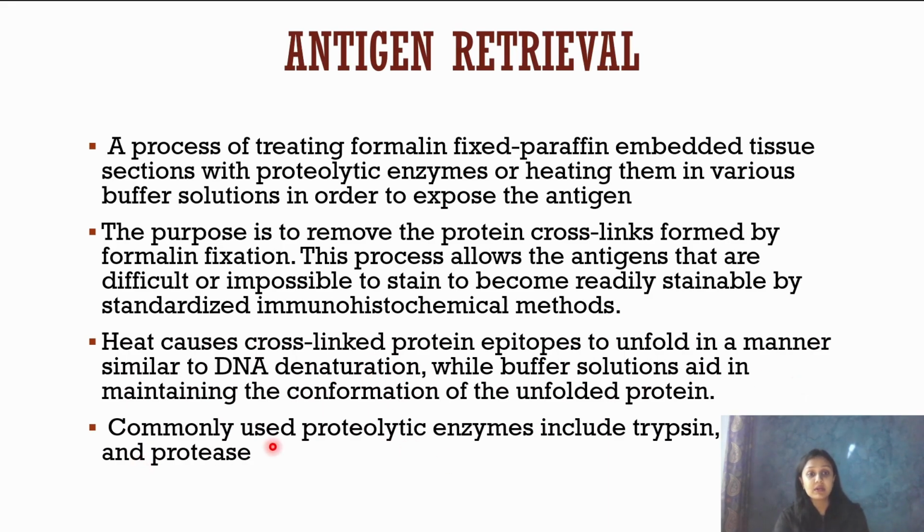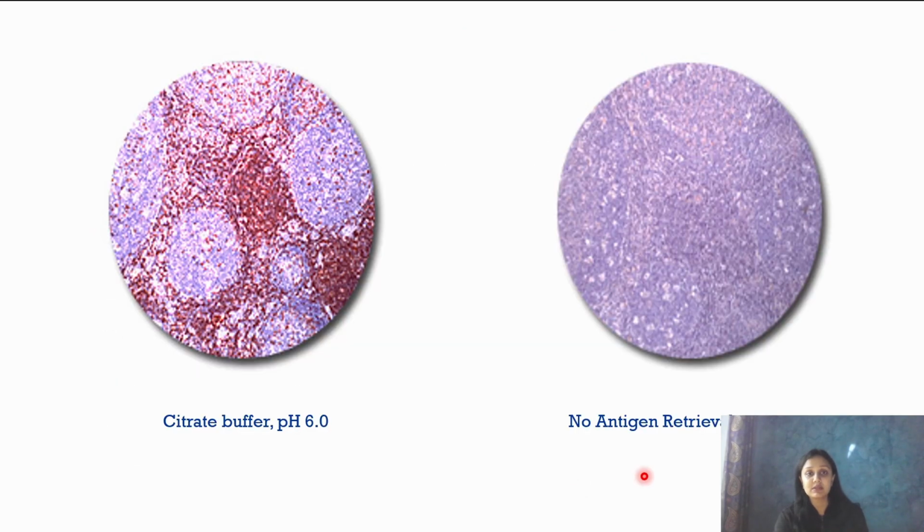Amongst these commonly used proteolytic enzymes are trypsin, pepsin, and proteases. See, here is the antigen which has been retrieved, and the buffer we used was citrate buffer. So the color is coming out beautifully, and here there was no antigen retrieval, right? So there is no color.